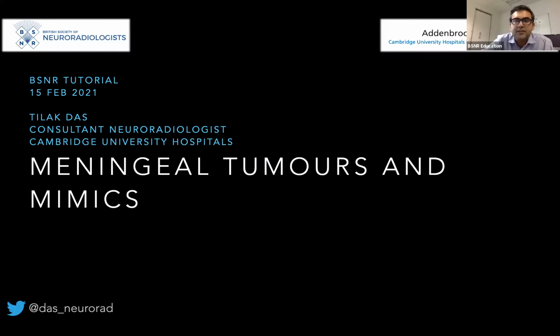Final question. You talked about methionine PET. Someone's asked if you have any experience with gallium DOTATATE to differentiate meningioma. I'm afraid I don't know. As far as I know, we don't do it in our institution either. I think we've done it every now and then, but it's usually not that helpful for distinguishing it from the things that you actually want to distinguish it from. But we've not used it in a post-surgical setting, so I'm not aware of that.